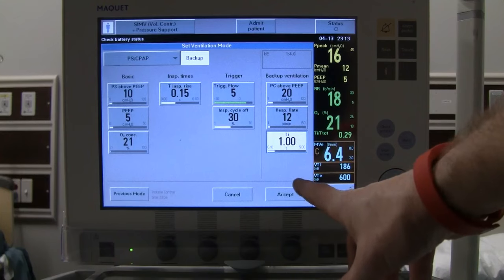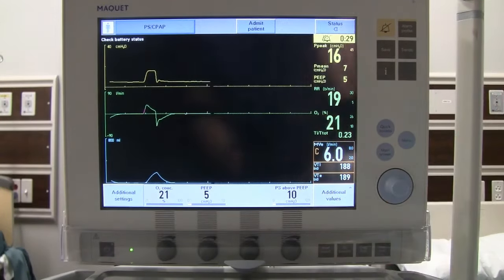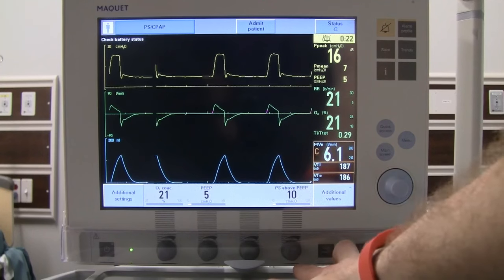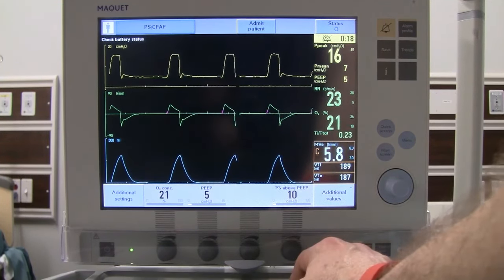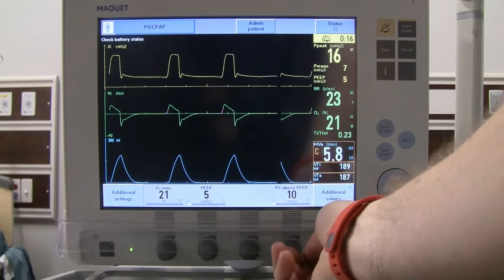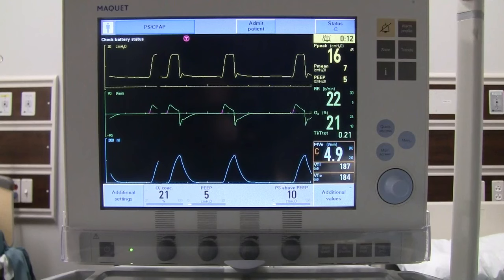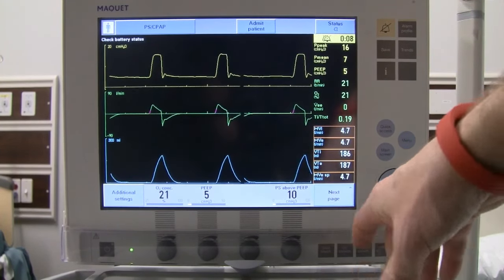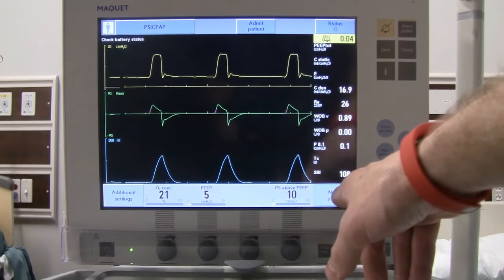We set pressure support above PEEP at 10, PEEP at 5, FiO2 at 21%, rise time at 0.15, and leave the inspiratory cycle-off at default. Once all settings are entered, say accept. Now in CPAP with pressure support of 10, we only have three direct-access fixed knobs: pressure support, PEEP, and O2. All return values are displayed on the right and can be scrolled through for documentation.